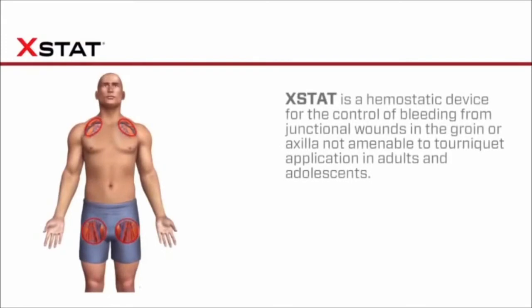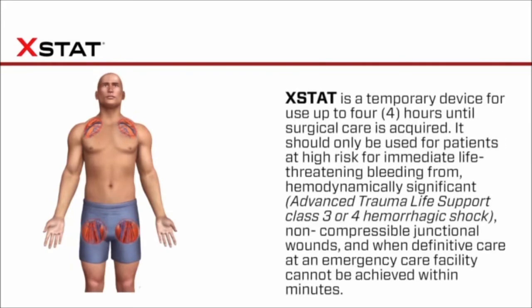XStat is a hemostatic device for the control of bleeding from junctional wounds in the groin or axilla, not amenable to tourniquet application in adults and adolescents. XStat is a temporary device for use up to 4 hours until surgical care is acquired.